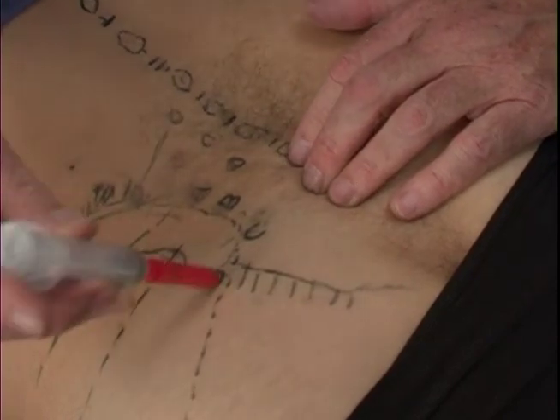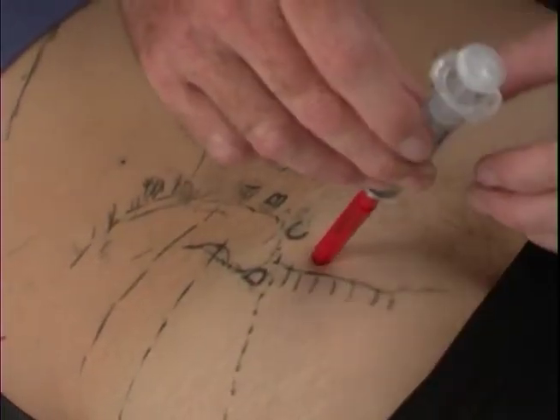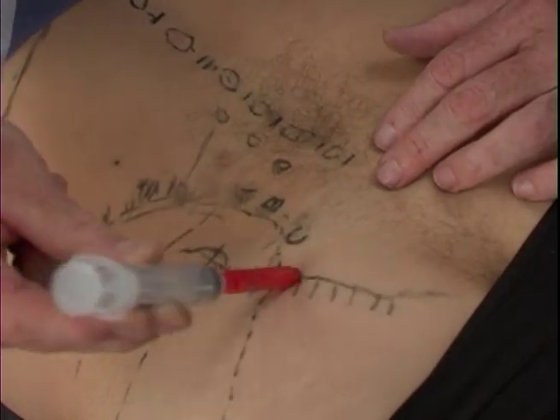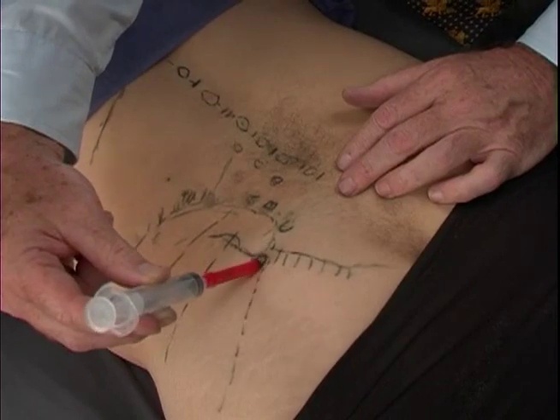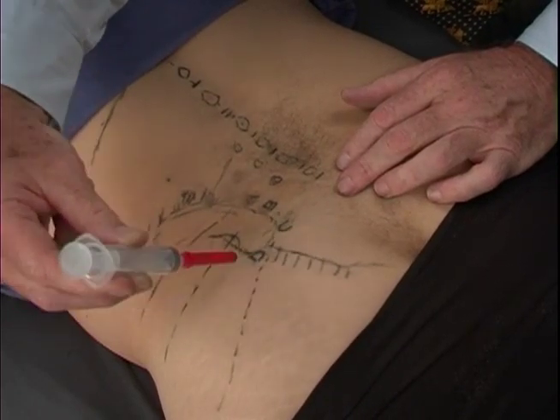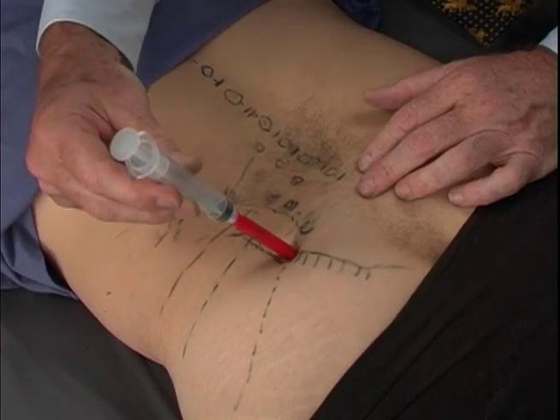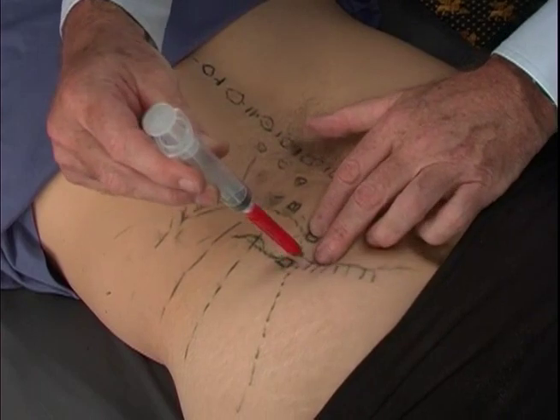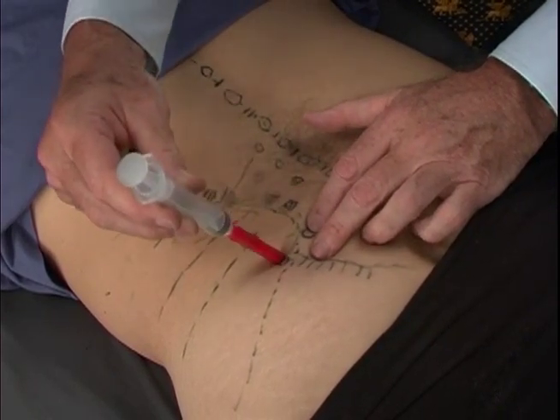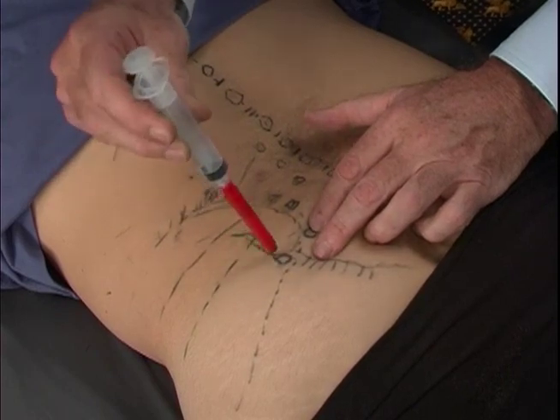We then come around to area D, and we have to reorient our needle as we come around this way, thinking about the anatomy so that our needle is oriented toward the spine to hit bone in this area. And again, using the techniques either of skin sliding and doing multiple injections or reorienting our needle a bit, we need to do multiple peppering of this tissue.